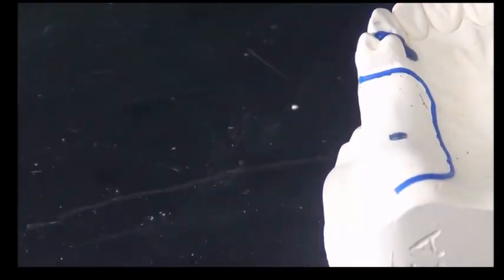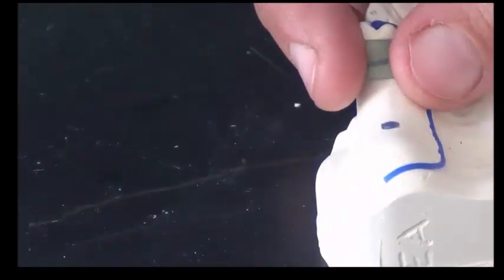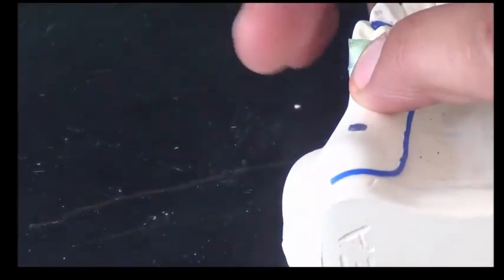On the free end saddle, we're going to follow the same steps, but the main difference is that there are no rests to join them, because the rest is separated from the guide plate here, because this is the free end saddle morphology and the RPI system doesn't tolerate it. So the guide plate actually touches the tooth up to the marginal ridge. So this is the marginal ridge. So we're reaching the marginal ridge.